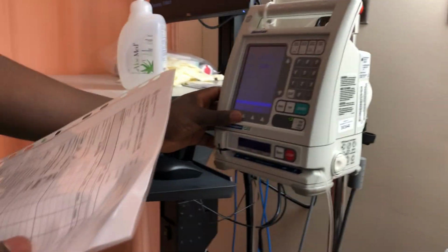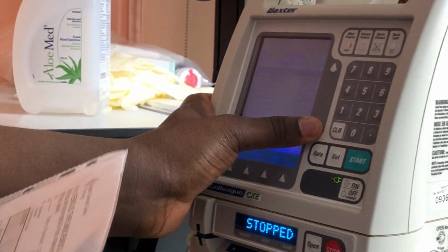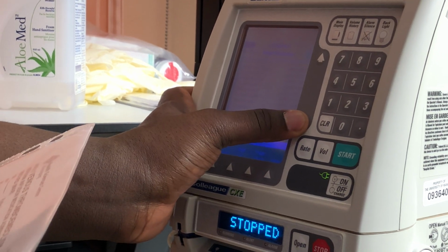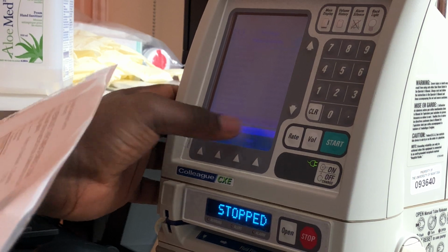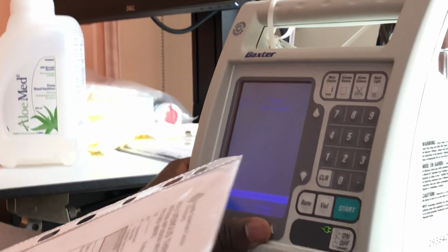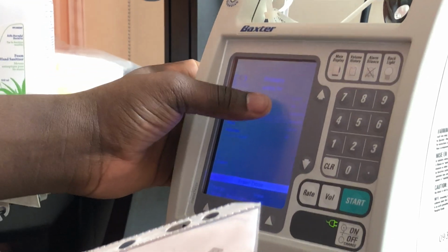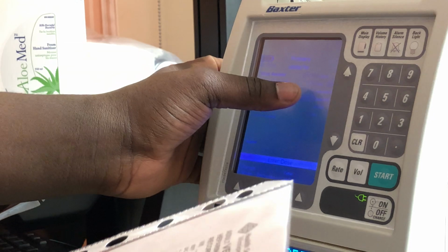So I'll go to my primary here, and I will go to Guardian to select my heparin. So I have heparin VTE here, which is the one which we're giving, and I select my level. It's 25,000 units, and final volume is 250 milliliters.